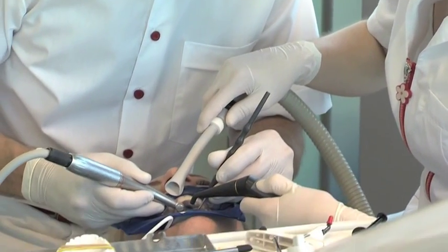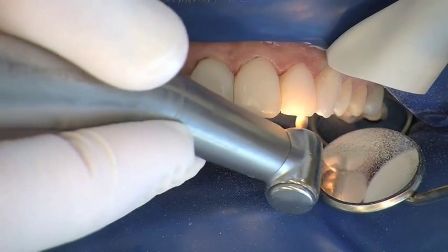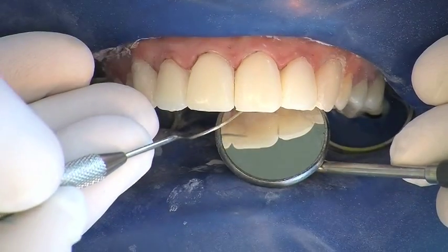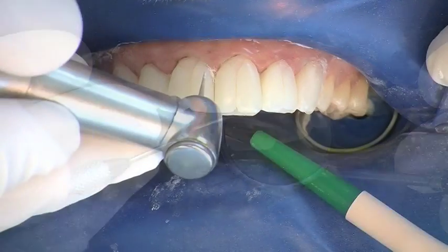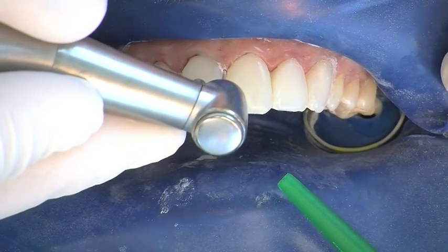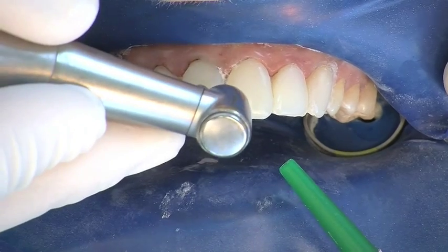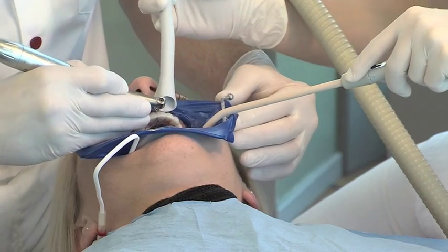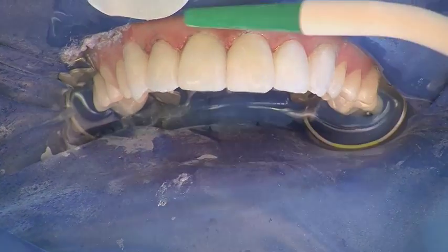Large excesses are removed palatally with a pear-shaped coarse diamond burr and surface continuity is checked by a probe. Cervical areas, especially towards the interdental areas, are treated with a thin 40-micrometre flame-shaped diamond burr. 40-micrometre ProxaShape files are used to achieve optimum smoothing cervically.